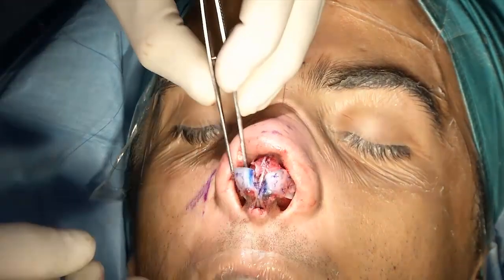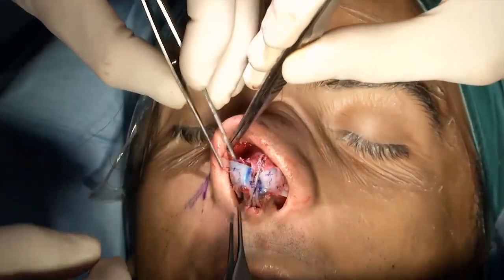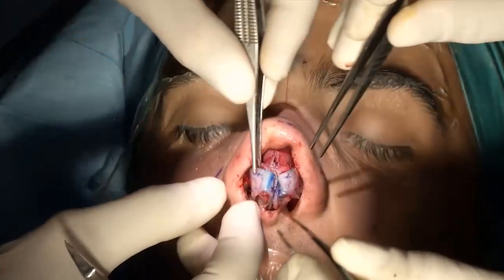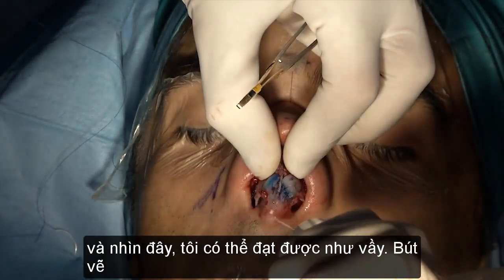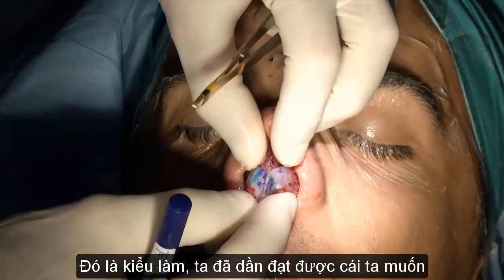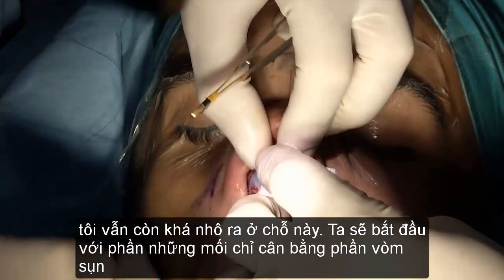So we'll free this even more. Give me the scissors. Careful here. I will fully release it like I did on the other side and see if I can get this right. Dry it. Dry gauze. That's the concept. I'm kind of gradually getting there. I still have some convexity here.